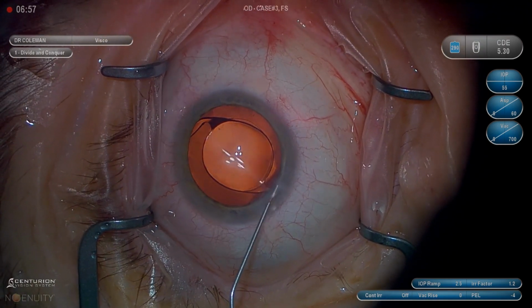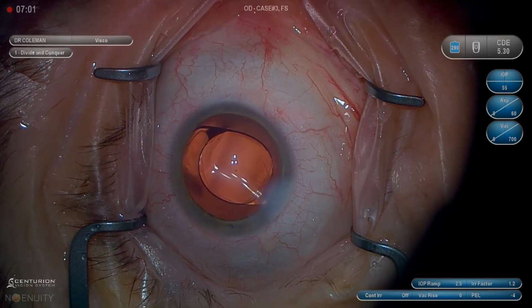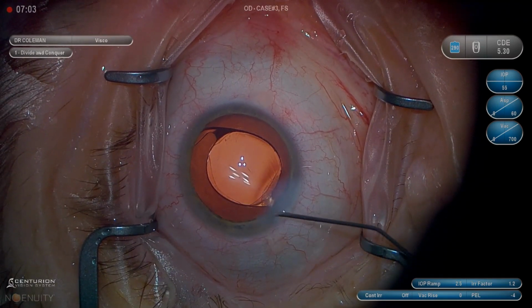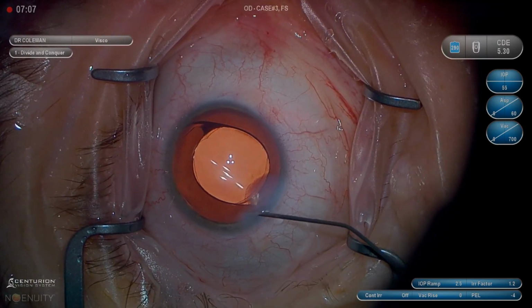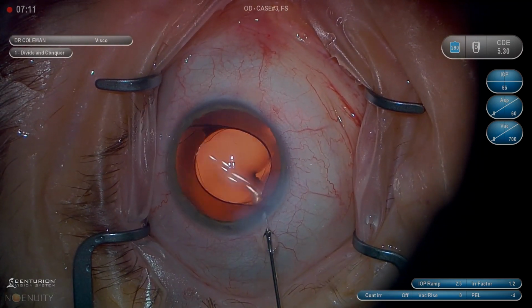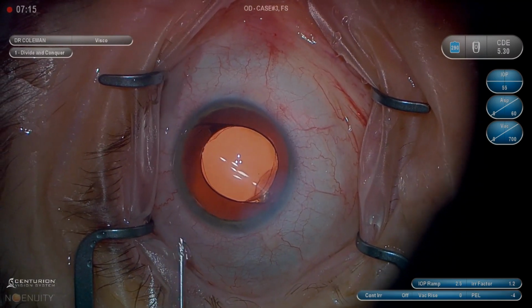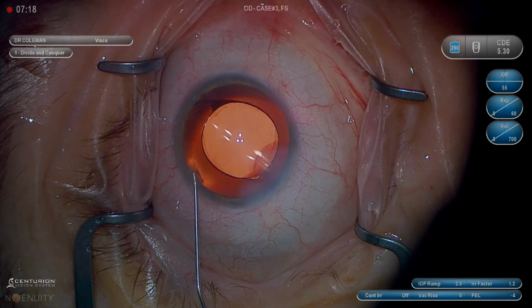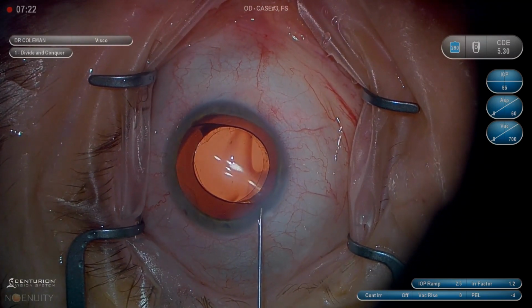And if you want to see what the total case time is, on these, you can look at the counter in the top left corner on the Ingenuity. So that's the total time, and this one's 7 minutes, so we'll see what the average is. So, in general, I'm going to talk through these cases as I've done in the previous ones, not necessarily in the order that's occurring on the screen, at least initially.